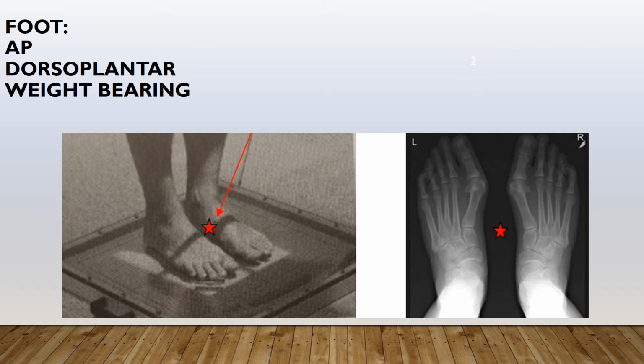We're also going to place a weight-bearing marker on this image so that the doctor reading the x-rays knows that this is a weight-bearing view.